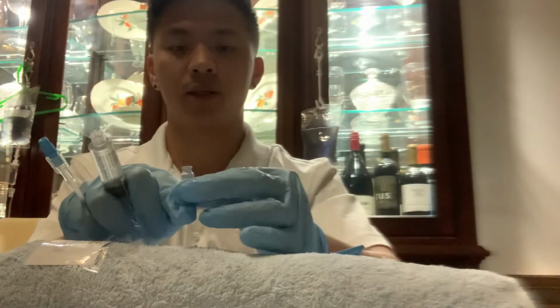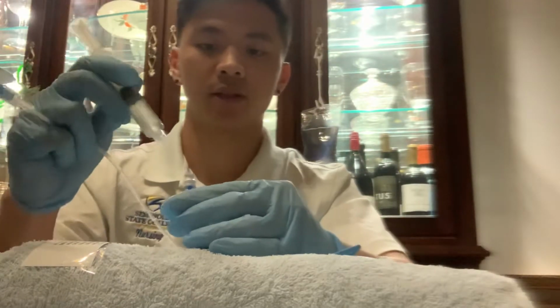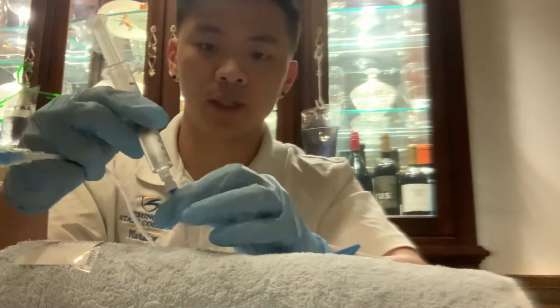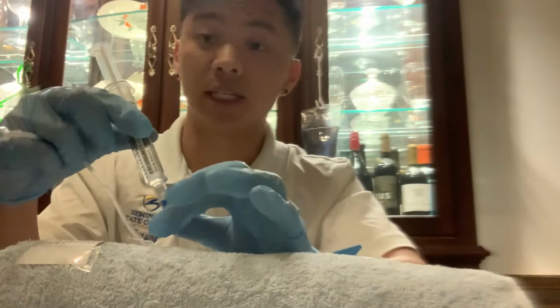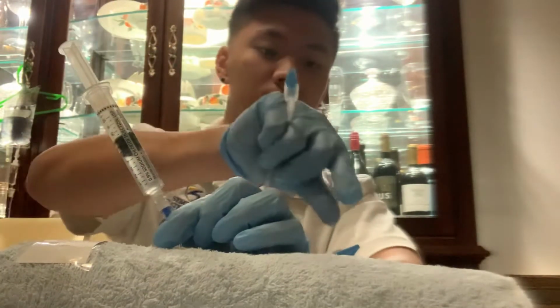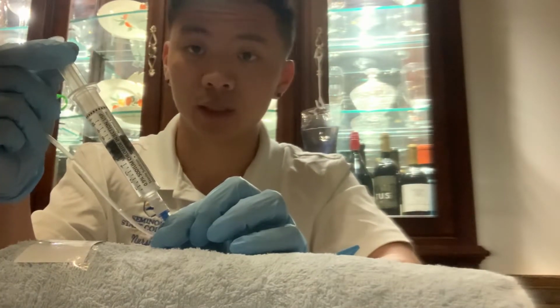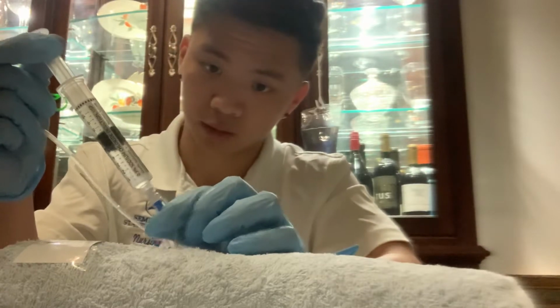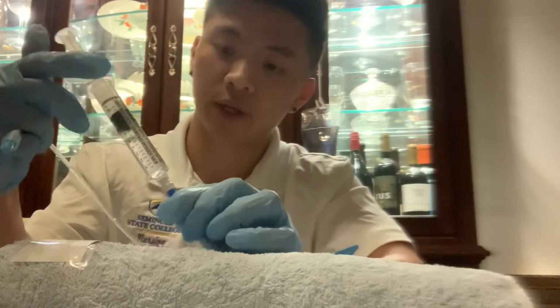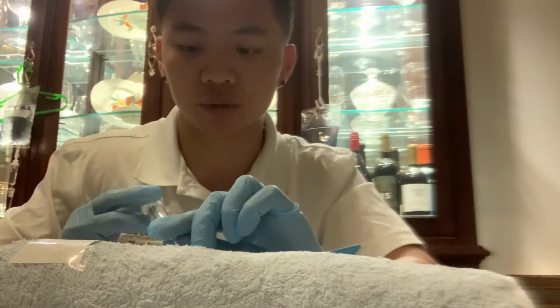I would go ahead and properly inject. I would go ahead and attach it to the saline lock, and I would unclamp the saline lock as well. Unclamped, and I would go ahead and aspirate for blood. Once I see blood return, I'm gonna go ahead and slowly inject 3 milliliters of saline.